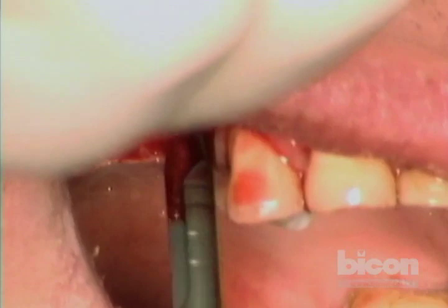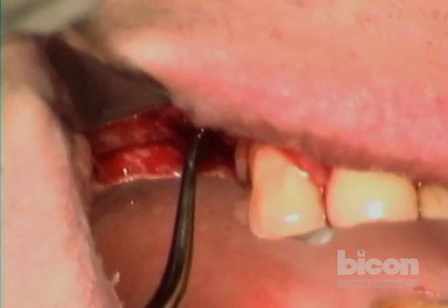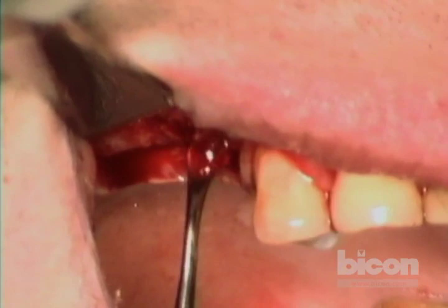Before I go to the final size, I'll take a straight curette first and then the hand reamer to finish off the osteotomy. I still have a floor intact — always a good thing — and we want to remove all of this excess bone. We don't want to compact it against the bottom if we don't need to.